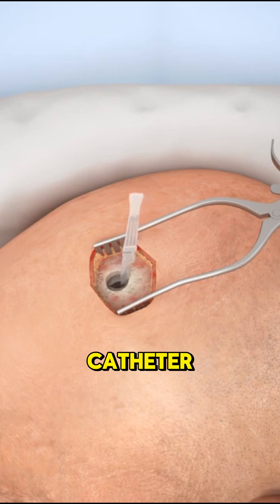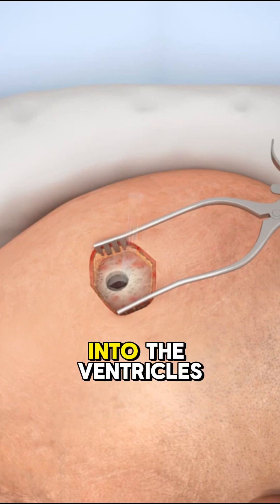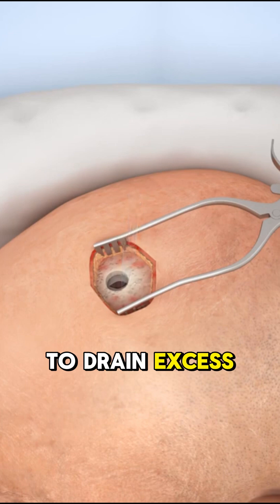Then comes the catheter. It's gently slid through the drilled hole into the ventricles of the brain to drain excess fluid.